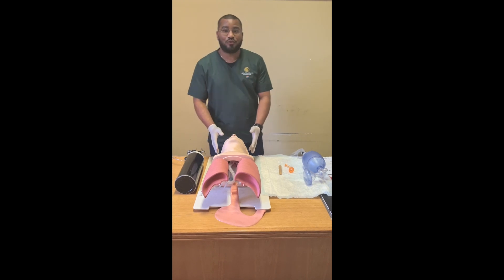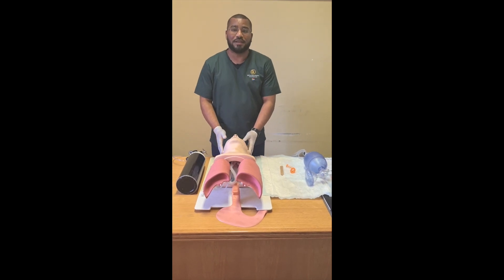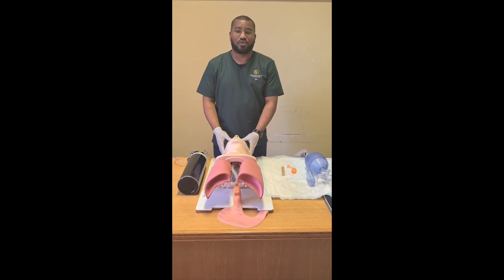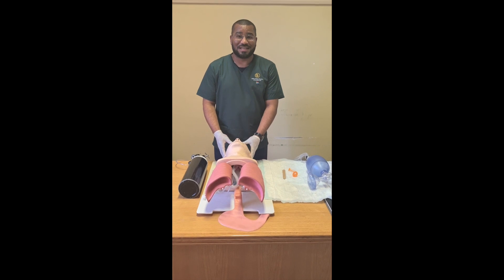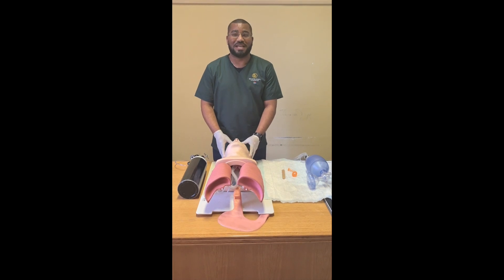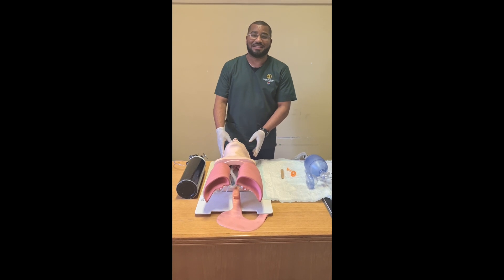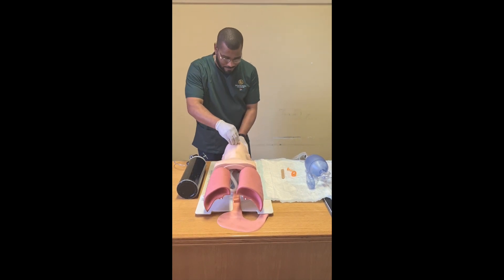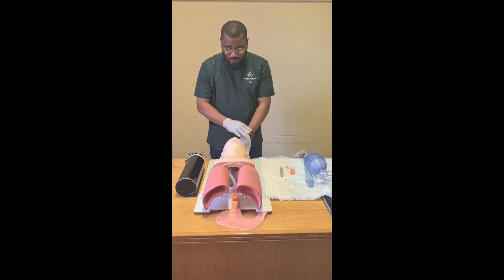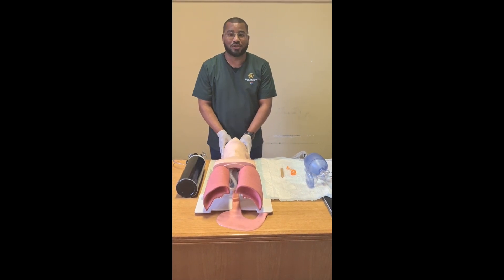I will start off this procedure by opening the patient's airway, which can be done by either using a head tilt-chin lift maneuver or a jaw thrust — jaw thrust in the case where there's a suspected spinal cord injury, which in this case is not applicable. Hence, I will proceed by using the head tilt-chin lift maneuver, opening the patient's airway and assessing it for any possible obstructions.